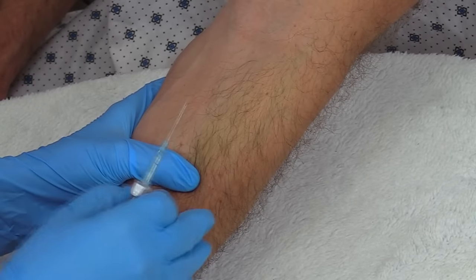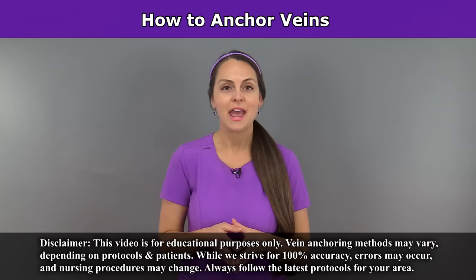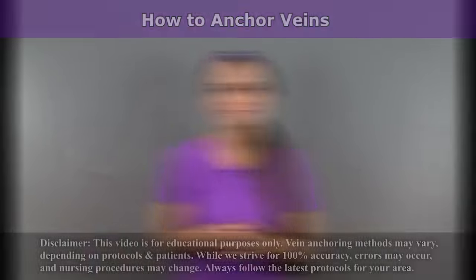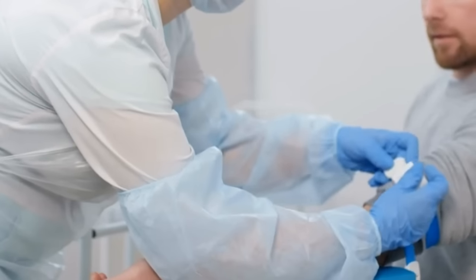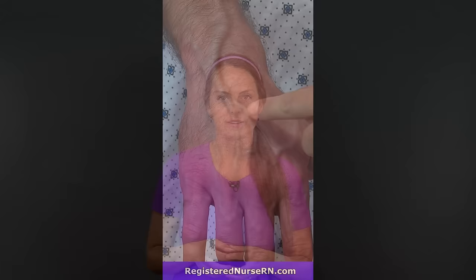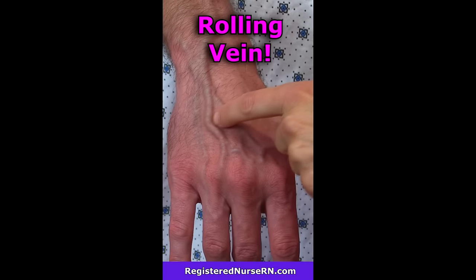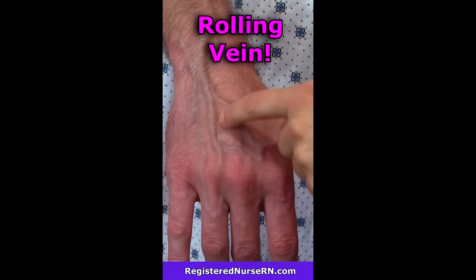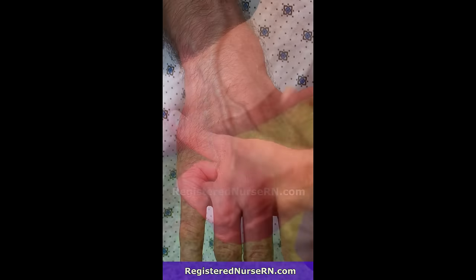One of the most important things you can do before you start an IV or draw blood is to properly anchor the vein before you stick it. Anchoring a vein will help prevent it from moving or rolling as you go to penetrate the skin with the needle. And in this video, I'm going to demonstrate how to anchor veins. The biggest reason nurses, phlebotomists, and other healthcare professionals need to anchor veins is because veins are quite mobile — whenever you go to penetrate the skin, it can cause that vein to roll or move to the side, which causes you to miss the vein.